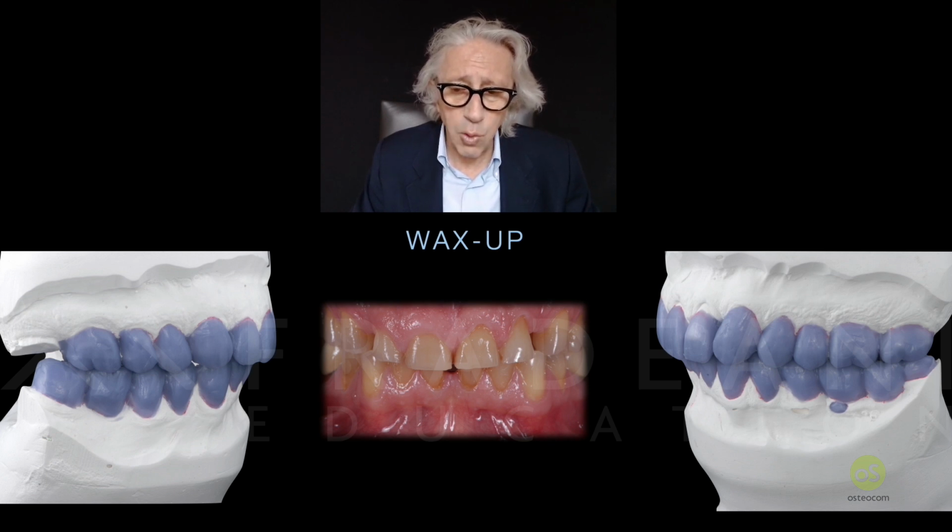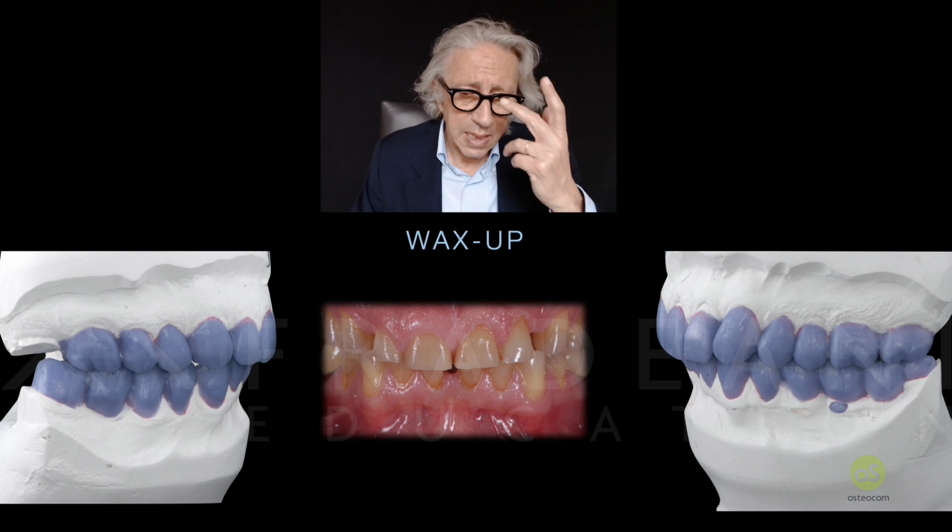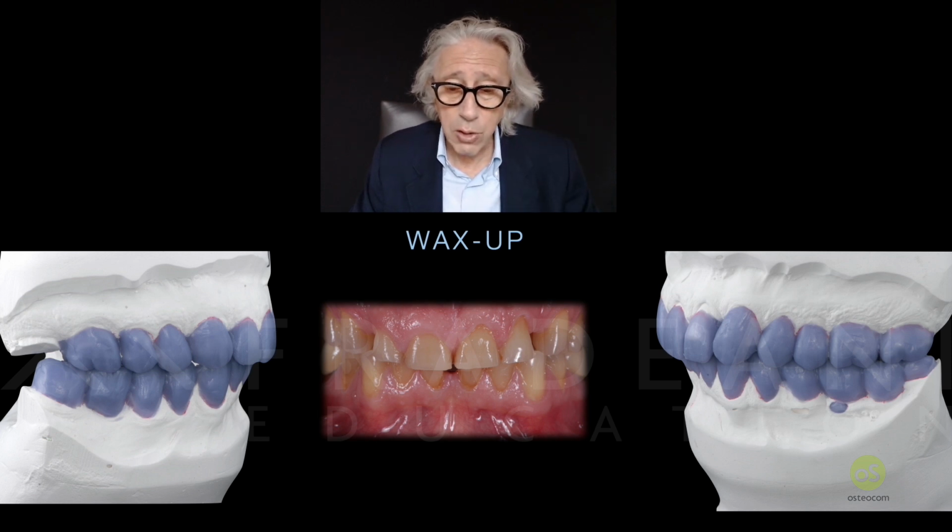And in this case, we have added so much volume that you have not touched the study model underneath, and we just applied more wax that completely covers the existing teeth. So if you want to do any kind of mock-up, you can do it, because a mock-up, as you know, is a reversible kind of solution. You can print this wax-up directly in the mouth with acrylic, bis-acrylic, and you can have the mock-up done. And then you can remove it once you have tested it, once you have approved it, once you have shown it to the patient, and you can decide whether to go ahead or not.